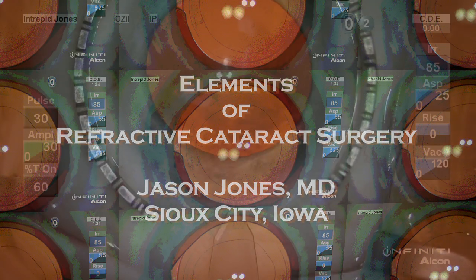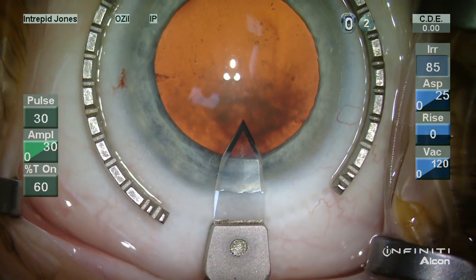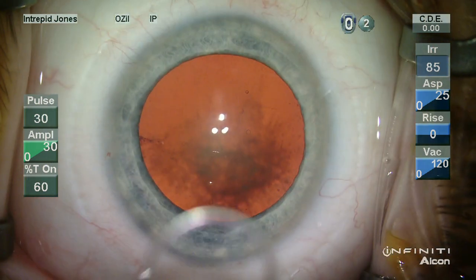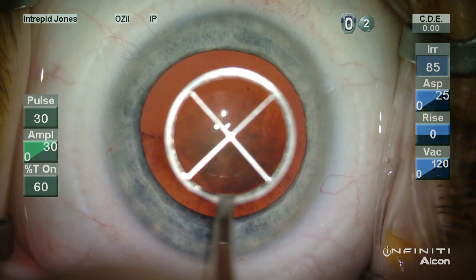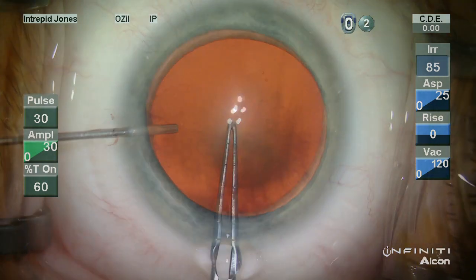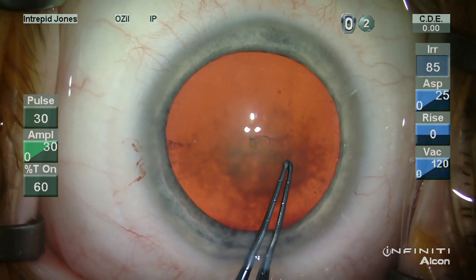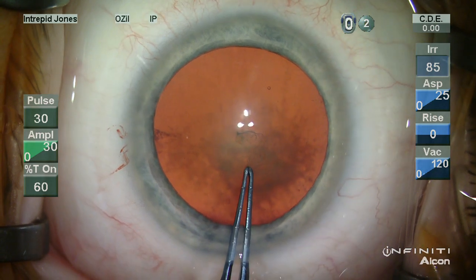With this video I'd like to demonstrate some of the elements of refractive cataract surgery. I use a standard 2.2 millimeter temporal clear corneal incision and I mark the cornea with a 5.75 millimeter capsulorhexis marker made by Mastel Precision.